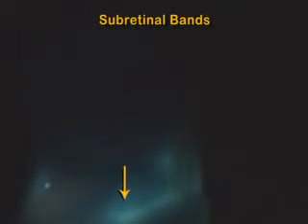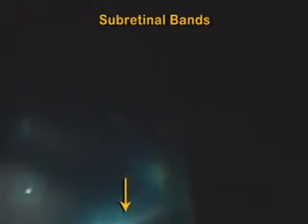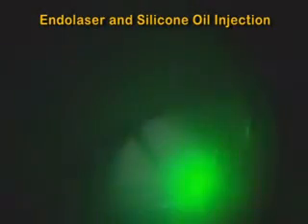While performing relaxing retinectomy, subretinal bands are encountered, which were the probable cause of unrelieved traction that encouraged the entry of subretinal air. Relaxing retinectomy is done in the attached supranasal quadrant also, lest it be the cause of subretinal air migration. 360 degrees of endolaser is performed at the edge of the retinectomy. Silicone oil is exchanged for PFCl, and encircling band is removed at the end of the surgery.